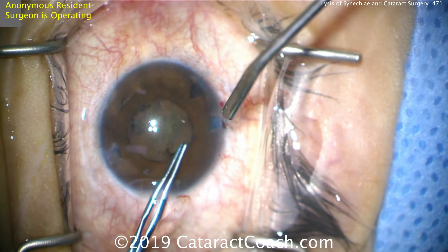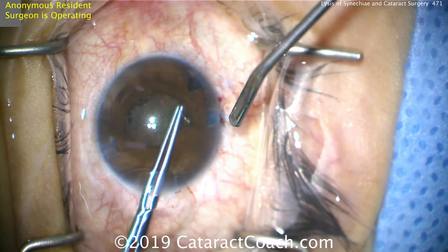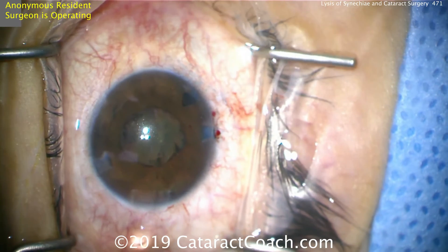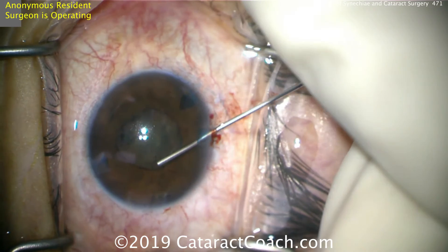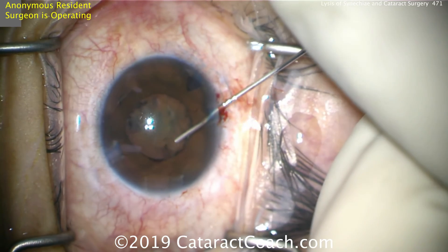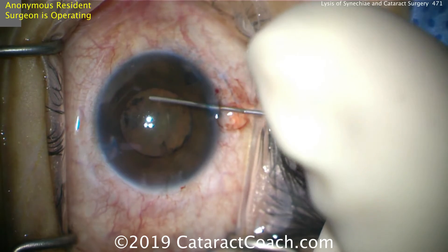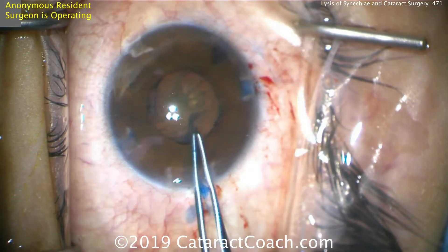You may get a little bit of iris bleeding right at the pupil margin, but a tiny amount of bleeding is really of no consequence. Take your time to peel off that membrane. There's another little piece about 180 degrees apart, but it's not too significant. So let's expand the pupil a little more, and now it's time for the capsulorrhexis.